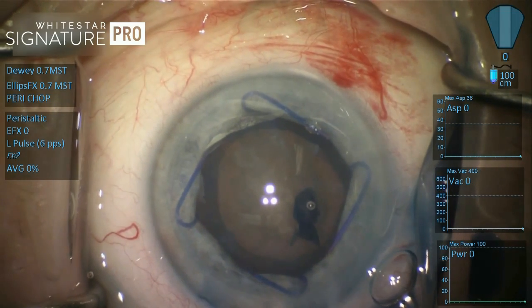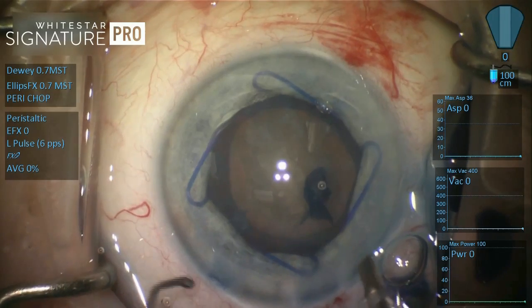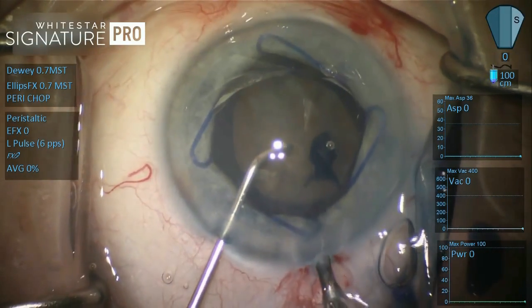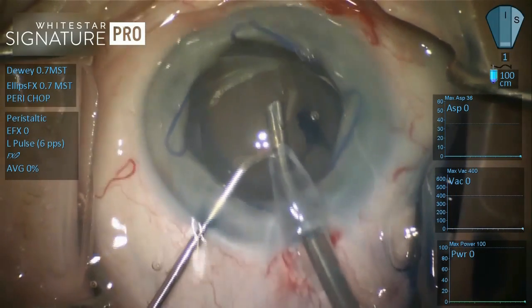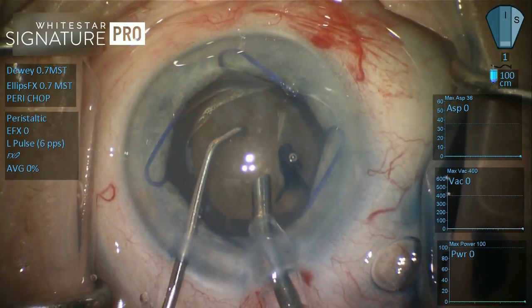And so I've asked my staff for our weapon of the day, which is a Dewey radius tip. And they have a repackaged needle on the counter, which is the next one in line. We had used the last one 20 cases, and it was time to break this one out. And as I'm looking, I'm realizing this needle isn't a radius tip. It has a sharp edge.